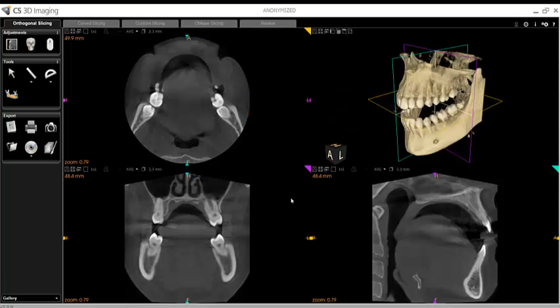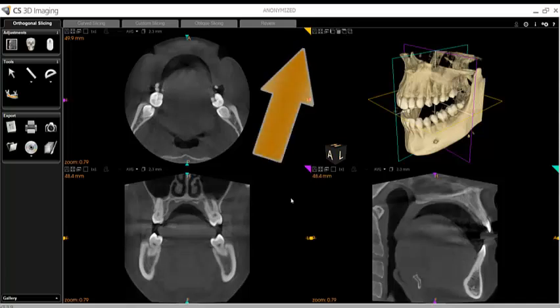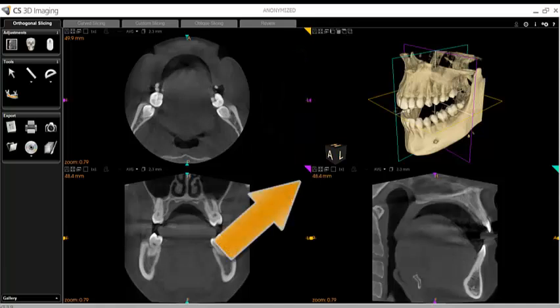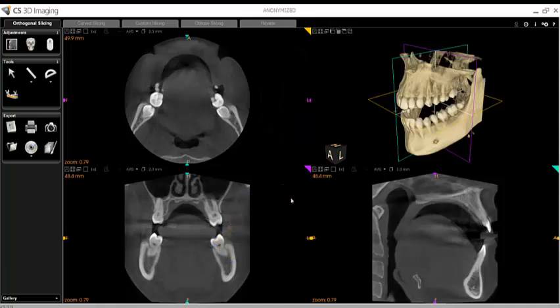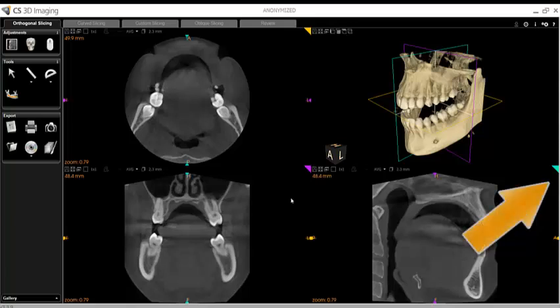Movement and navigation through the different views may be done in two ways. Please note that all of the different views are color-coded. In the Axial View, there is a yellow tab in the upper right-hand corner. In the Coronal View, there is a pink tab, and in the Sagittal, a blue-green tab.